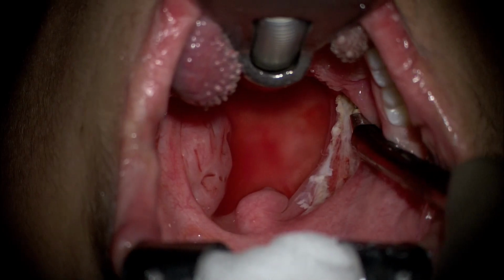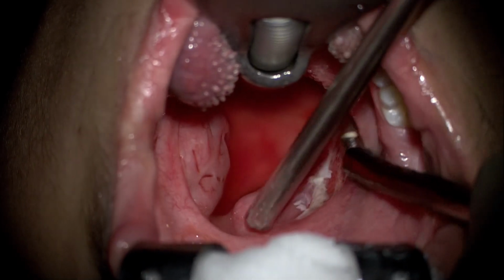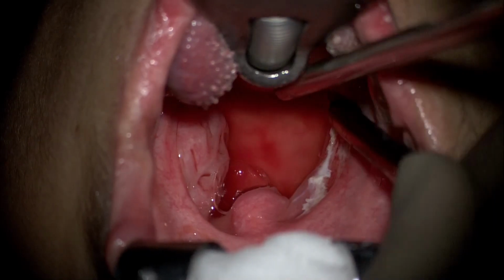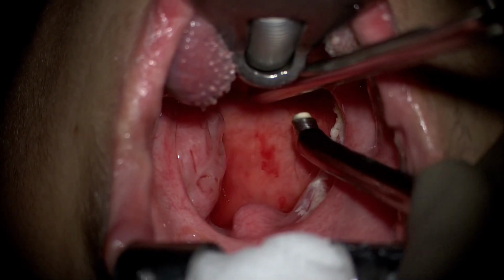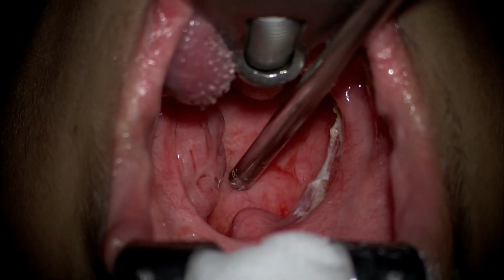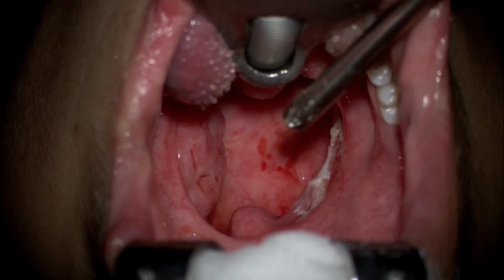As you see here, there is fairly good preservation of the anterior and posterior pillar. There is no bleeding anywhere to be seen. The slightest amount of exposure of the muscle on the posterior pillar is evident, but that's not so much and should not lead to any significant excessive pain.